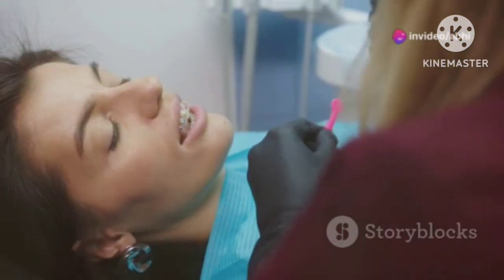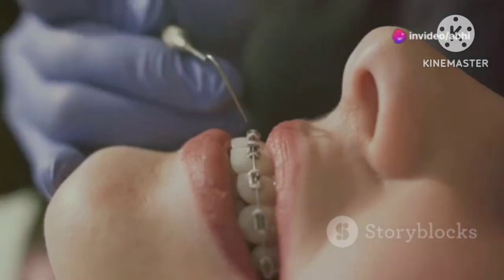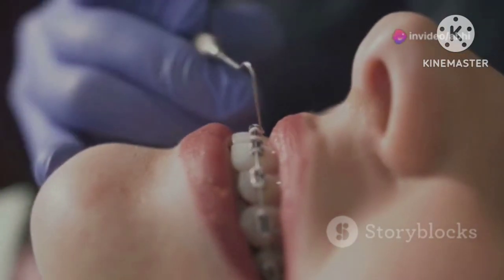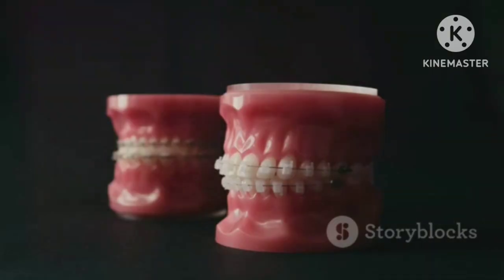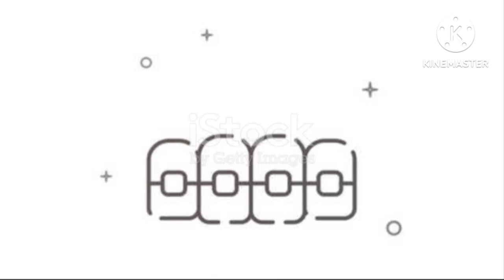Over time, the wire splint will help to make sure your teeth stay in place without moving. So, if your teeth are doing the tango, ask your dentist about wire splinting. It's a simple, effective way to keep your smile strong and steady. Remember, a little wire can make a big difference.